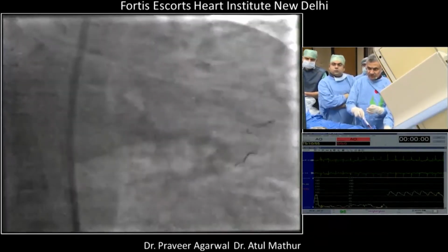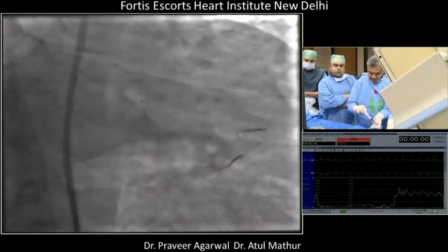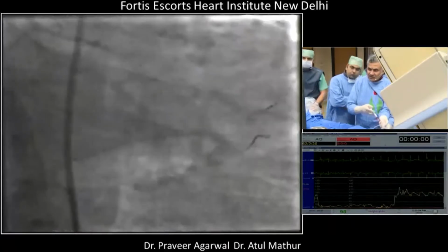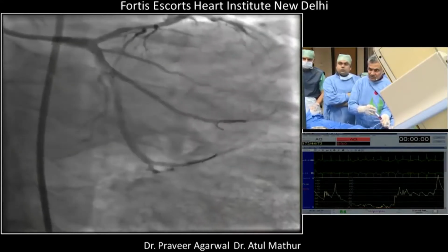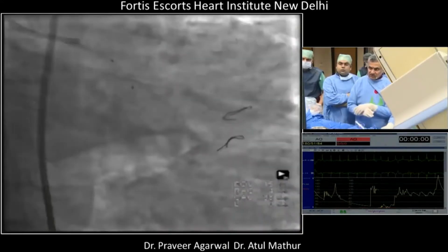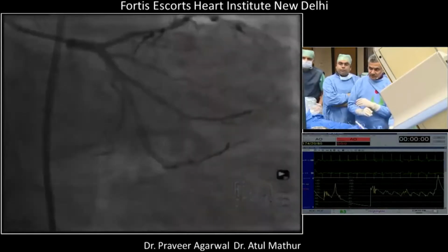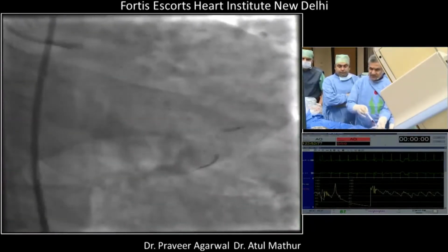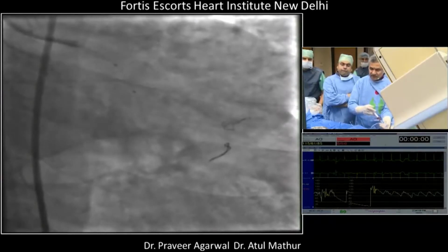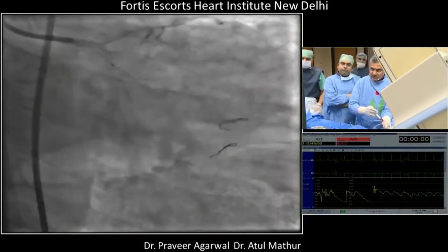How many people pull out the wire for the first crush? Right. No, it's not required to be removed. All right, we crush. अभी थोड़ा सा आगे कर दें कुछ approximately हो जाएगा. You're going to remove the wire? No, check, please. Okay.